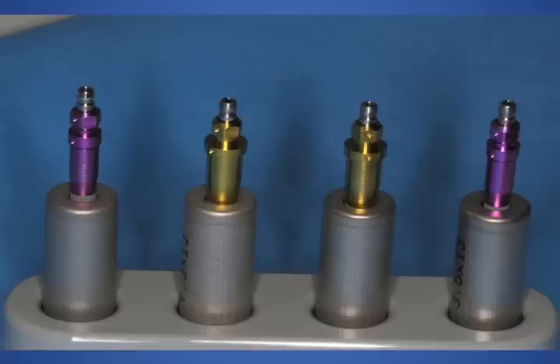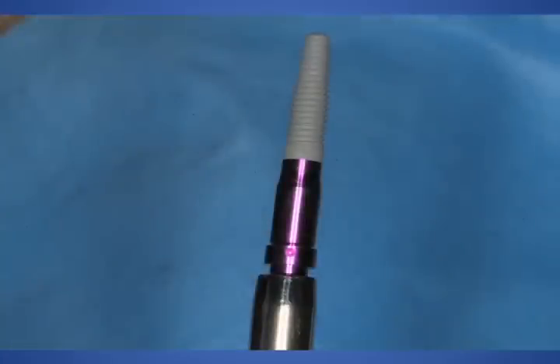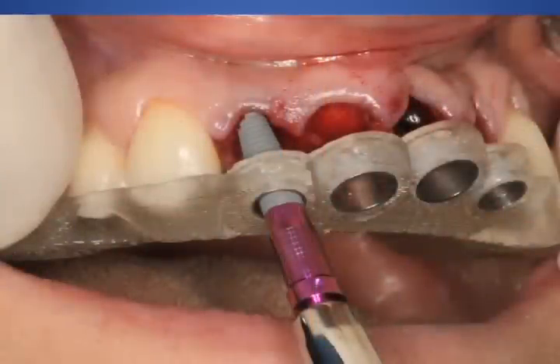Now you can see that these are a little bit longer than normal transferring copings with the Replace system. Again, everything is very precise in the system. It's very exact, and the length compensates for the thickness of the surgical guide, the rings, and the level of the crestal bone.